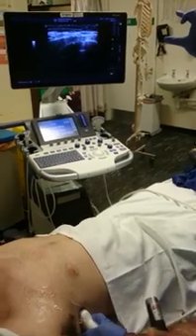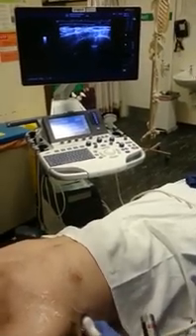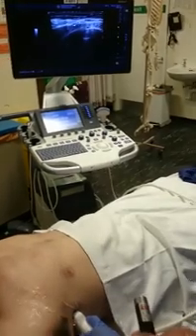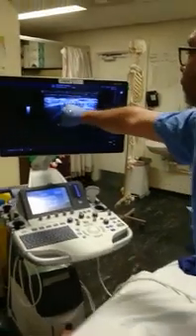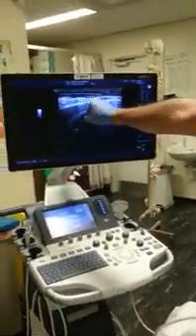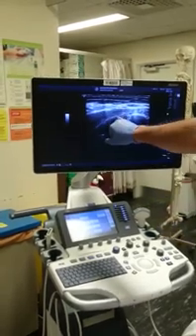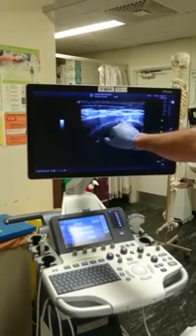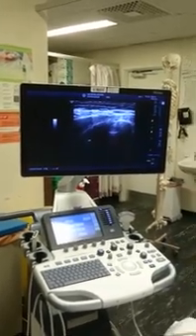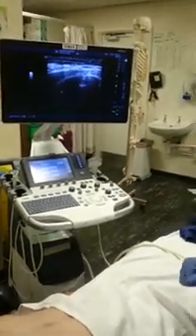You should see two ribs, you should see the pleura, you should see the thoracodorsal artery at the top and a triangular muscle which is the lat dorsi. Freeze it. If you do it between the two close to the neurovascular bundle, it is the serratus anterior plane block. You can come more close towards the external intercostal and do it below the serratus muscle, but that causes higher absorption into the blood and can cause local anesthetic toxicity.